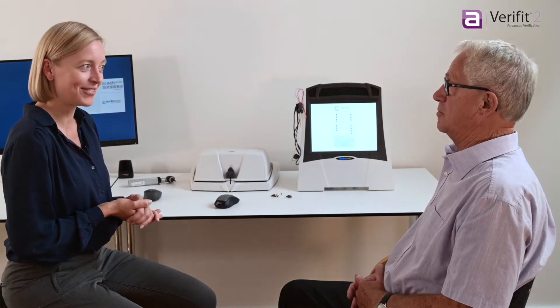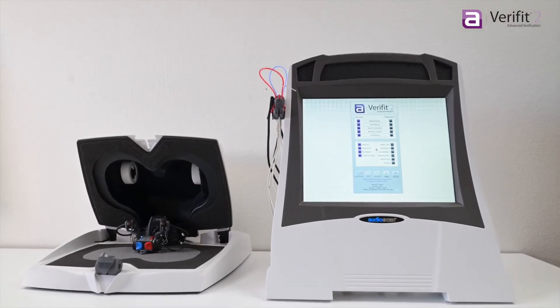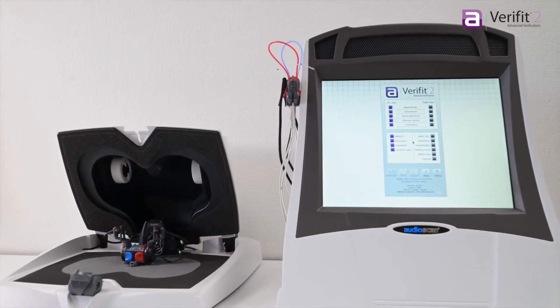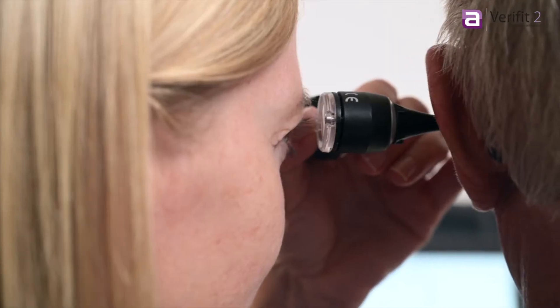As hearing care professionals, we want to deliver the best possible hearing experience for our clients. The Verifit2 Verification System provides precise and flexible hearing instrument verification, as well as tools to deal with the most challenging fittings.